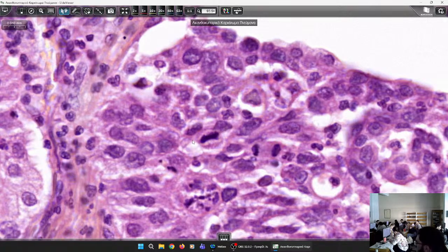What method is there to confirm the type of the tumor? Apart from hematoxylin and eosin, what will you use? Yes, please. Yes, you have P40, which is a nuclear marker. It stains the nuclei of squamous carcinoma cells. You perform the stain. All these cells are P40 positive. So you understand that this is squamous cell carcinoma. However, the differentiation is not so good, because it had those solid structures without evident keratinization. So it appears to be of high grade. Yes, please.